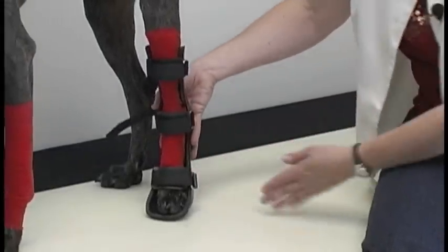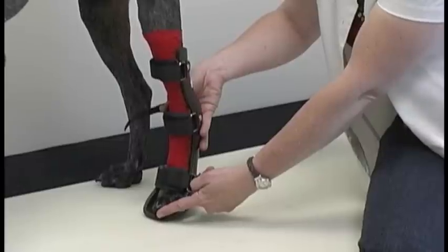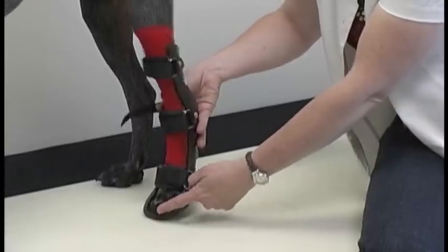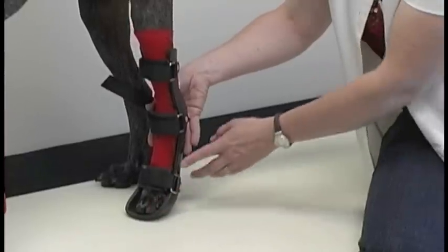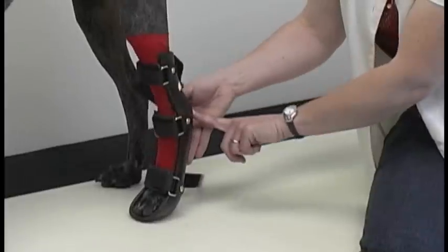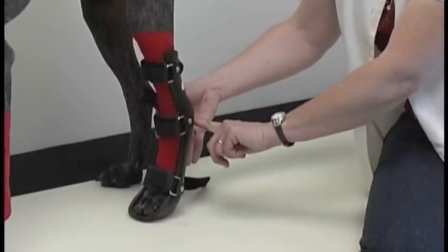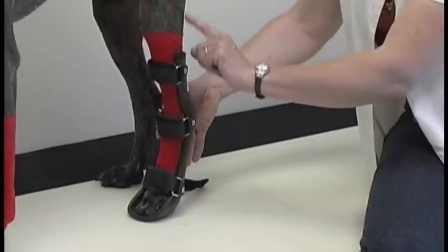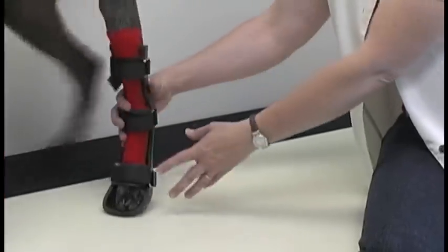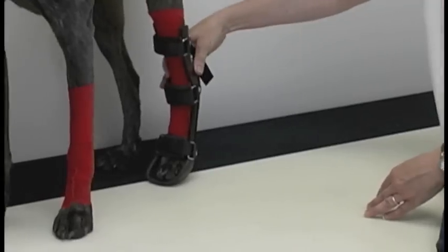This is how a rear limb splint should fit. Again, the toenails are not completely hanging over the edge and the pads of the toes are on the bottom of the splint. The hock or the heel sits nicely in the relief — the molded area for it — and it extends up about two inches below the knee. This allows the dog to sit comfortably and walk around comfortably.